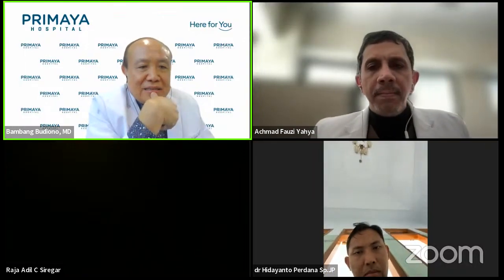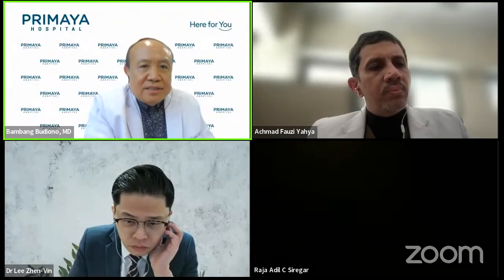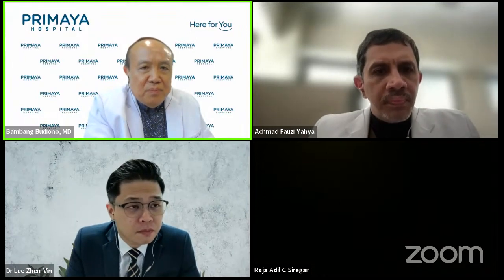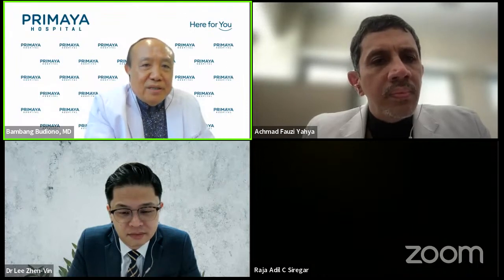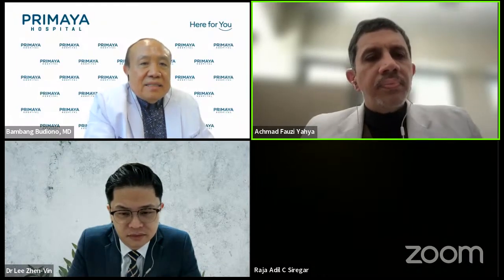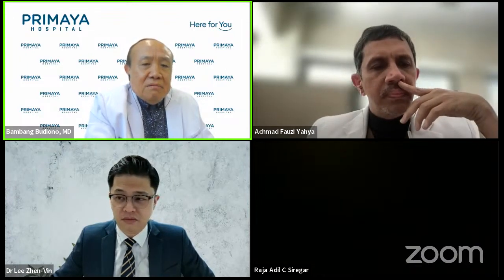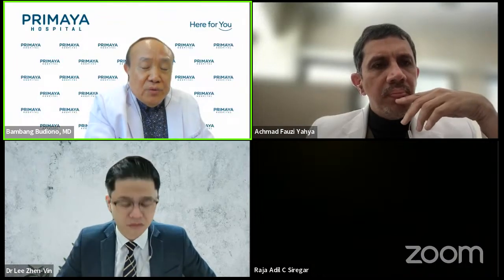So let me take the opportunity to ask you first. I can conclude that CCTA is very crucial in terms of the preparation, or what modalities you probably need to deal with in the cath lab before the procedure. Exactly. As we know, patients with chronic kidney disease are quite numerous, so what is your cutoff point for not sending patients for CT angio?